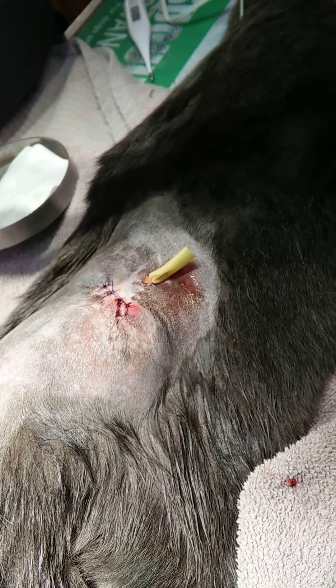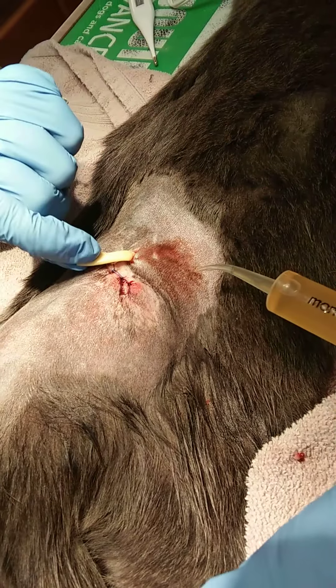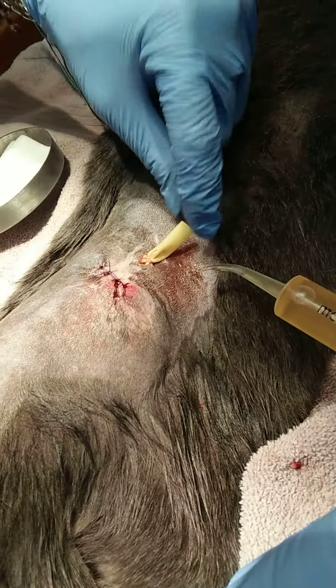The syringe is really tight. So then you'll come to the opposite end, behind the drain, not in it.